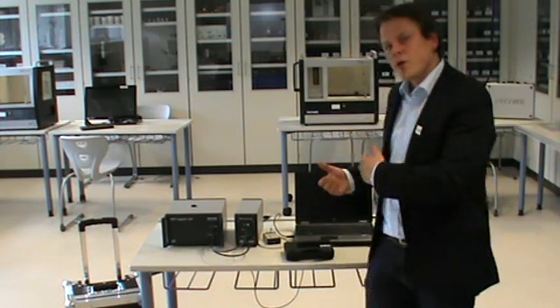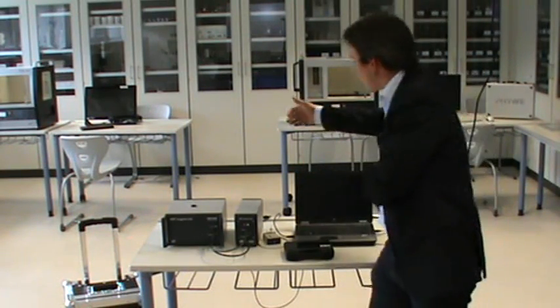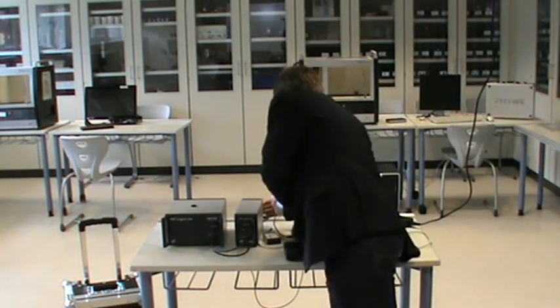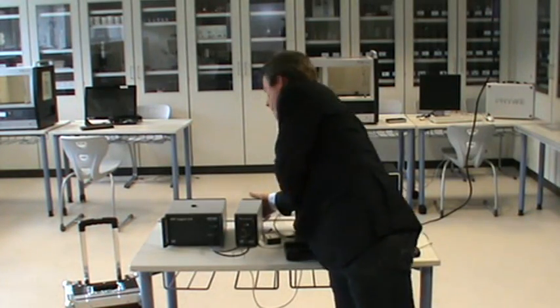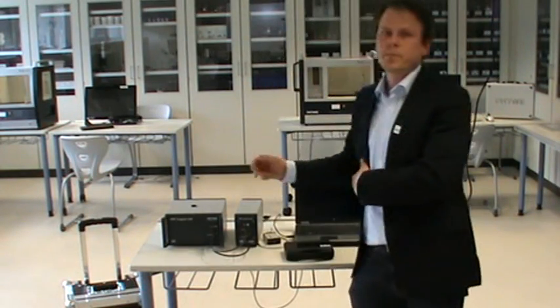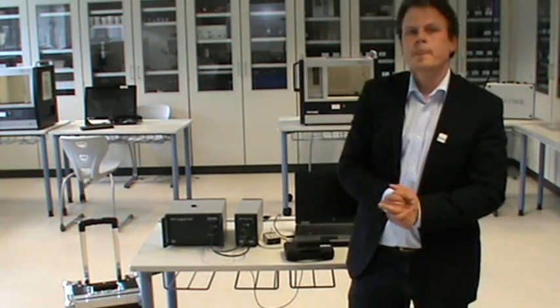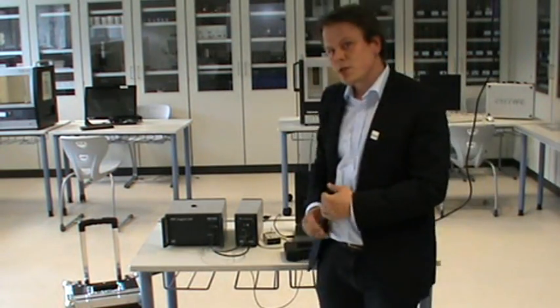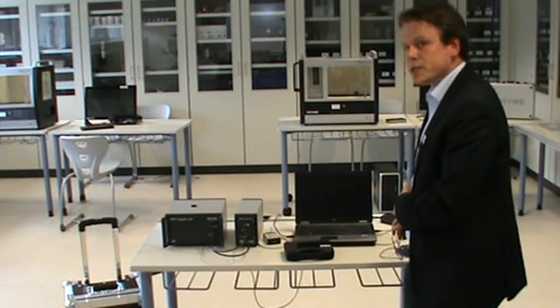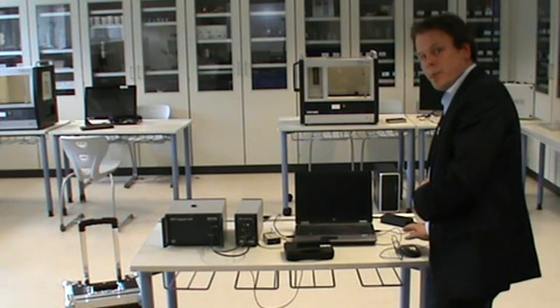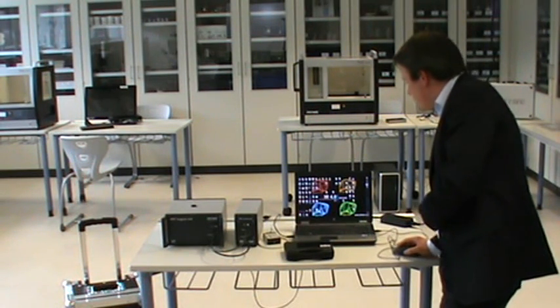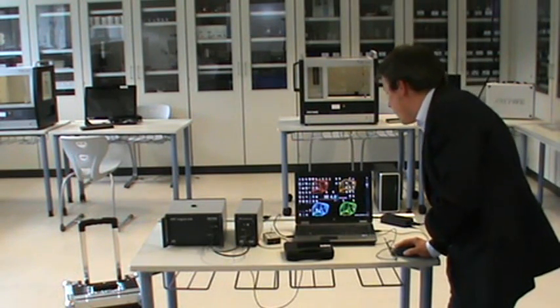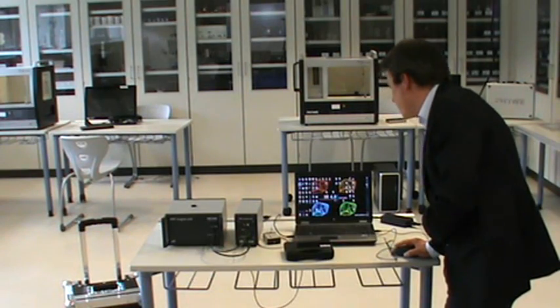Now, turn on the system with the power switch on the back of the control unit and start the software MeasureMRT by double-clicking on the corresponding symbol here on your measurement computer.